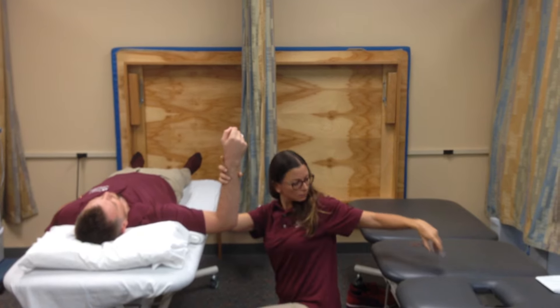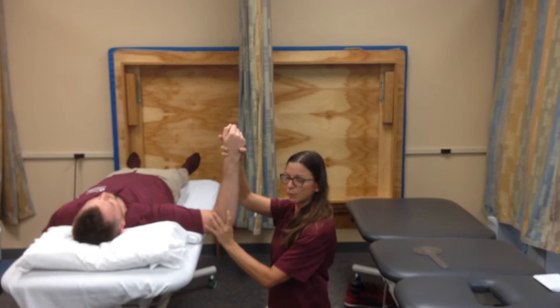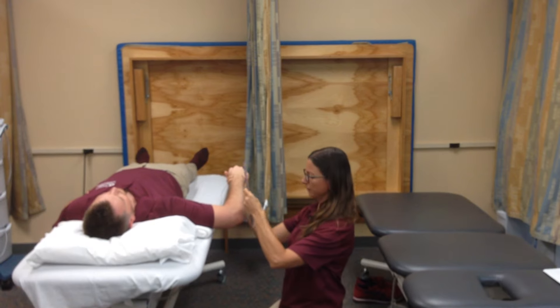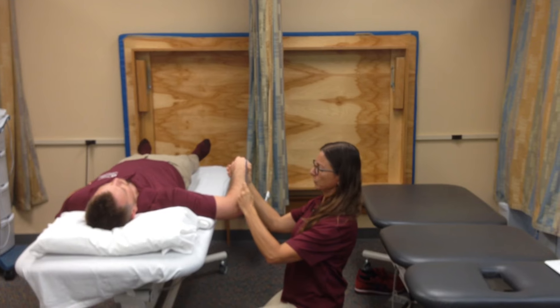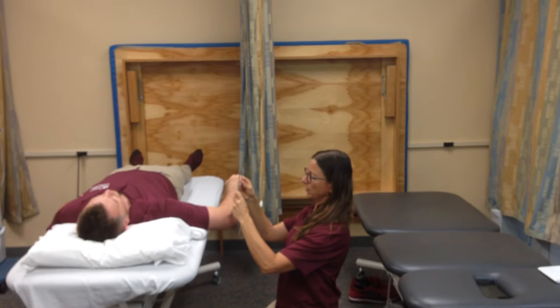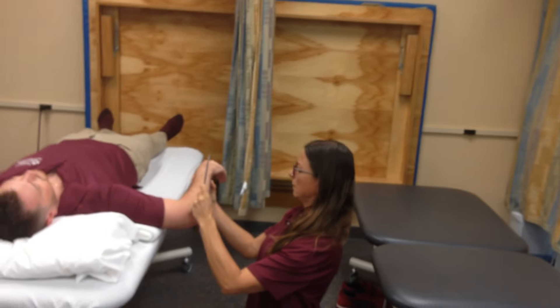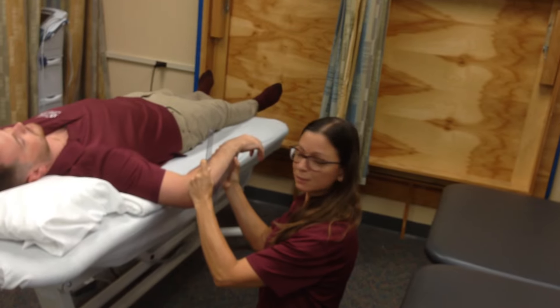Remove the goniometer and perform the full motion. Again, align with the anatomical landmark, which is the olecranon process. The proximal arm is perpendicular to the floor and the distal arm is aligned to the ulna. It's 70 degrees, which is normal.